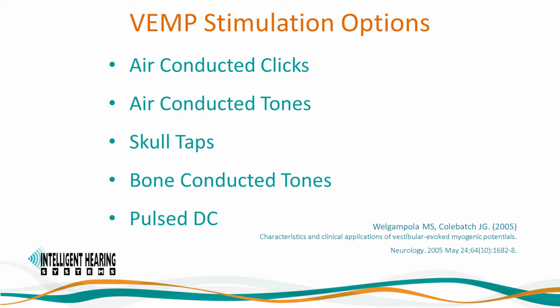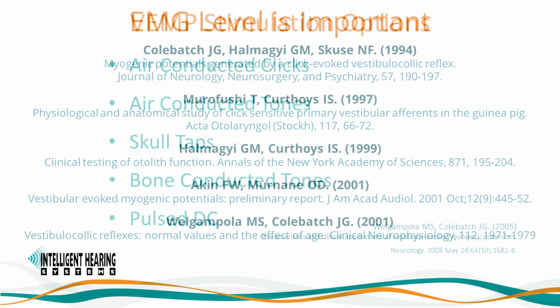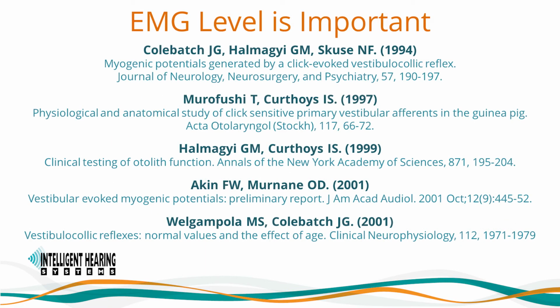Stimulus characteristics are affected by the type of presentation being used. The vestibular evoked myogenic potential is an evoked muscular response that is elicited by the presentation of loud sounds such as clicks or tone bursts, tapping or vibrating the skull with a bone vibrator or skull tapper, and galvanic electric stimulation. As presented earlier, VEMP amplitude is affected by tonic EMG level.